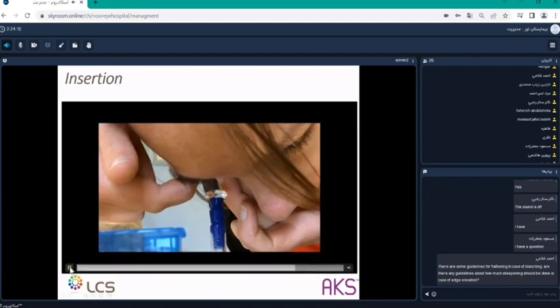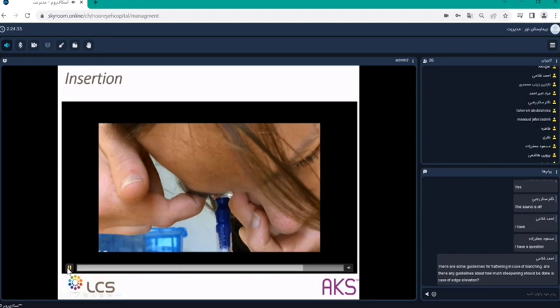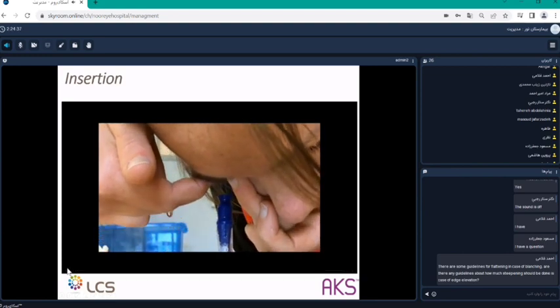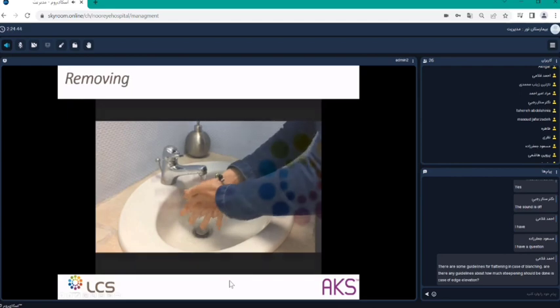And also sometimes we have seen patients who have lost their arms. That happens. So they need to have someone who opens the lids, and they have to bend like that. So some small tricks like that can help and can solve the fitting. Okay, and once again, that works. So that's how to insert the lens.